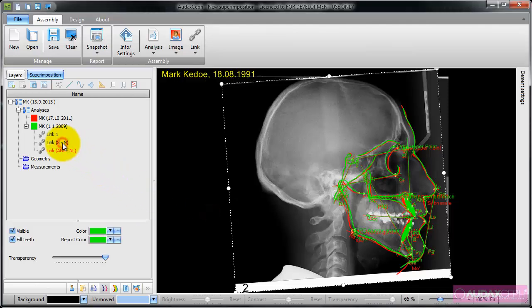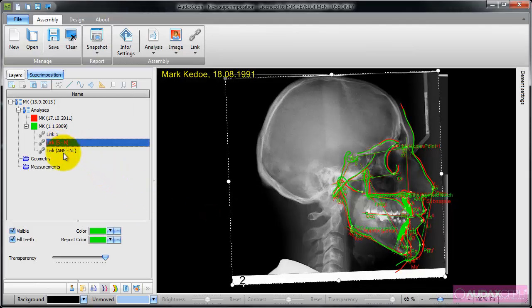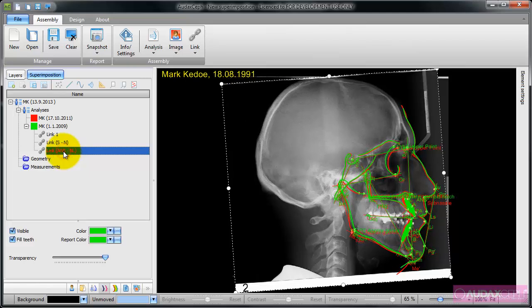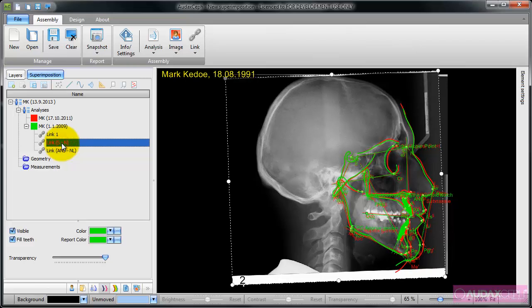When I switch between the analyses, I go to the tree, the superimposition tree, and then I simply click on the existing link.